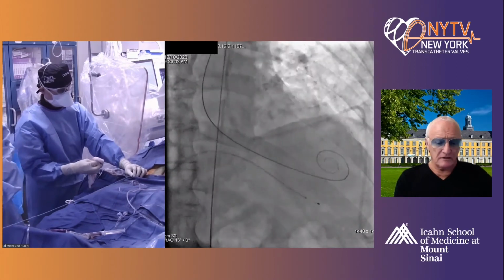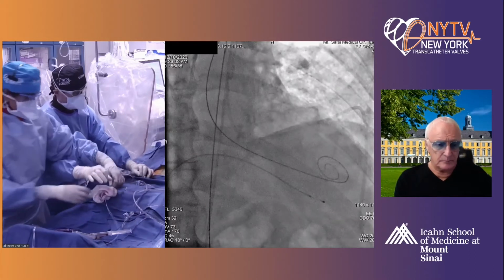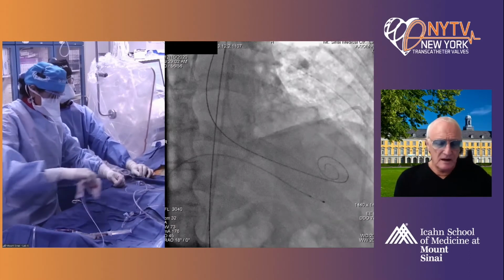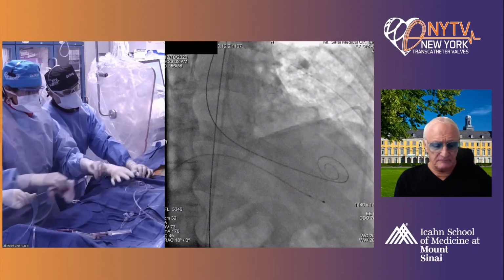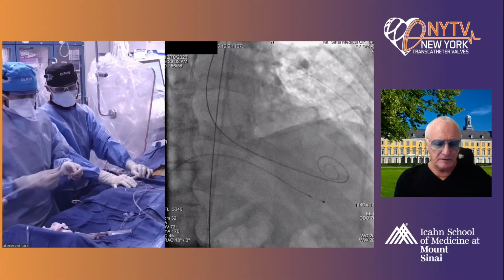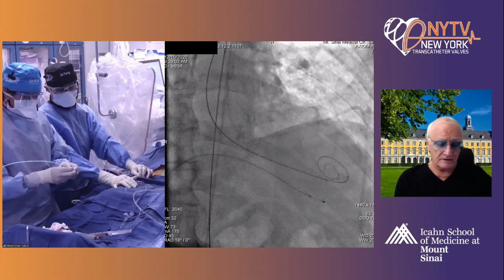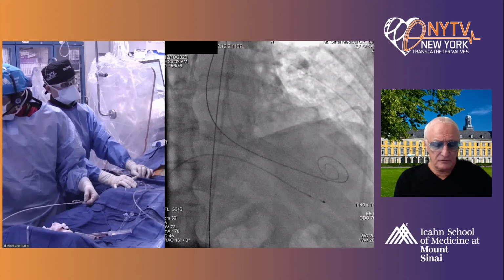because as you know, the valve will never be circular. I've never been really impressed by annular measurements, and so I would not oversize the CoreValve. The reason being that if you oversize, the valve is being pulled into the ventricle, which you don't want. So here I would probably go with a 29 Evolut or Evolut Pro.